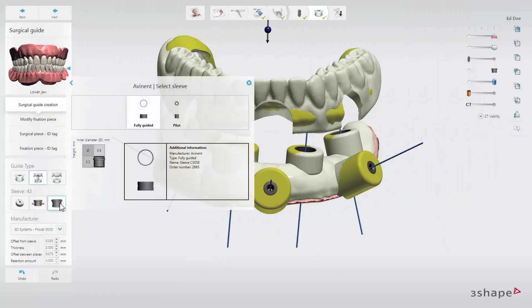By clicking the Select Sleeve button, you will open up the sleeve selector, where you can choose between different sleeve types.